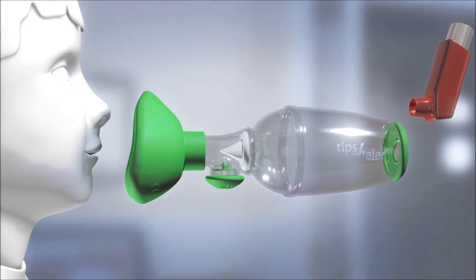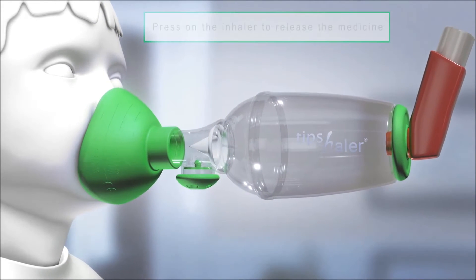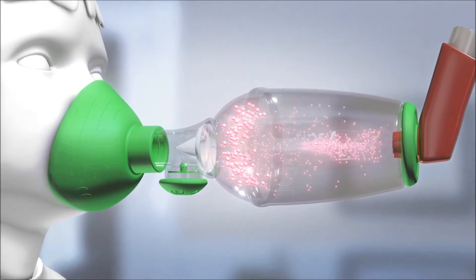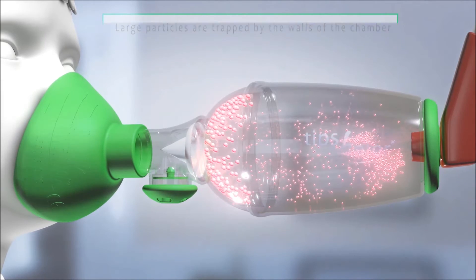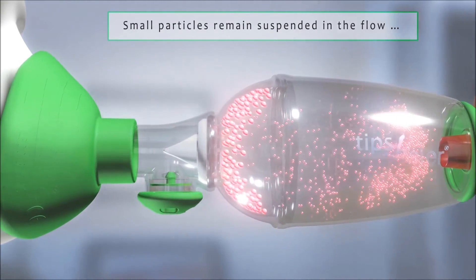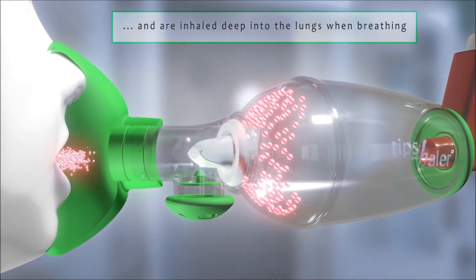Metered dose inhalers release particles of medication in the chamber in an aerosol form. Tipshaler walls quickly catch large particles and avoid impacting the mouth and the throat. Meanwhile, small particles remain suspended in the flow. Selected through Tipshaler and its ISOBreath valve, small particles are inhaled deep into the lungs where their efficiency will be maximum.